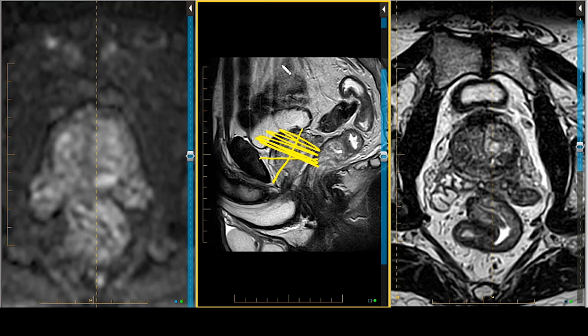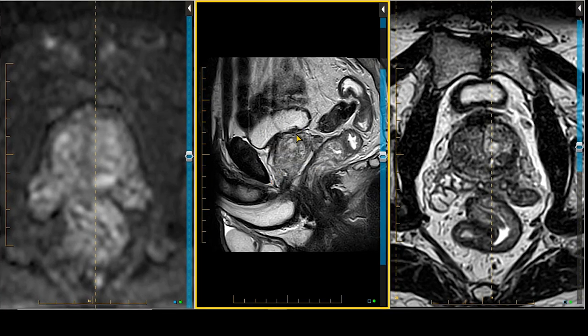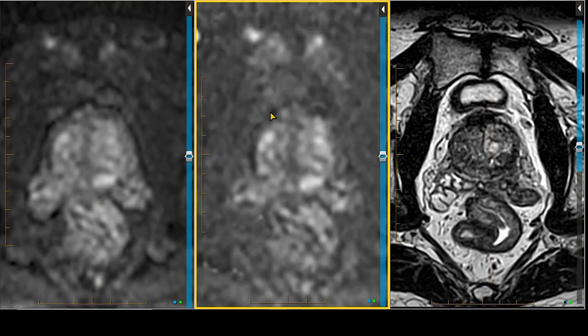As long as you're consistent — specifically with the T2 and the diffusion — so that you have a nice match in terms of angle orientation, angle location, and slice thickness. This way you can scroll up and down together. Let's pull down the diffusion again.